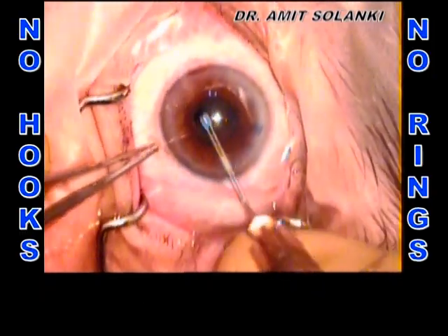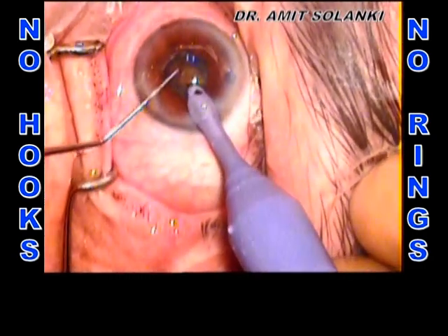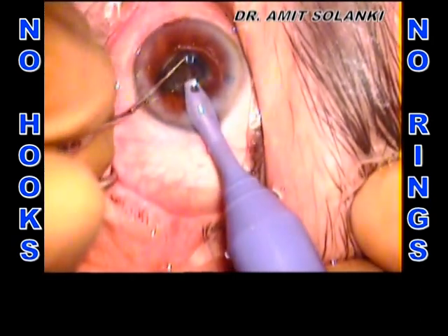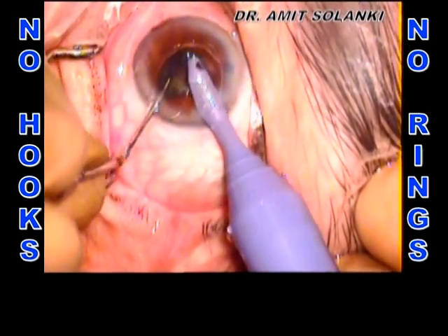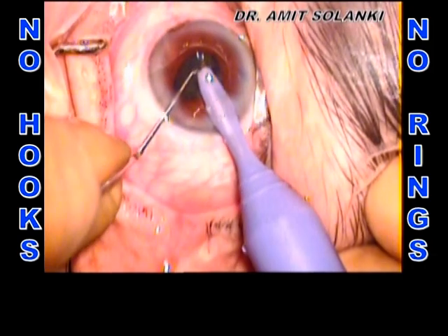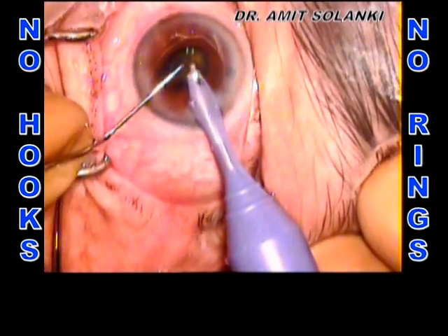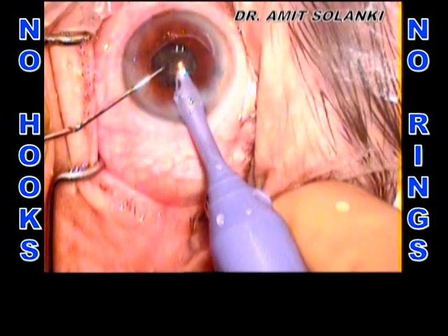After hydrodissection and nucleus rotation, the first step of phaco is the initial crack using the chopper and phaco tip. The center of the endonucleus was buried with the phaco tip, and then the vertical element of the chopper was depressed posteriorly to initiate the crack. The heminucleus was then mechanically divided into multiple small fragments using the phaco chop technique. Make sure that chopper movements are restricted within the rhexis margin — if it moves from periphery to center, it may tear the anterior capsule. The divided smaller nuclear fragments can be consumed within the central area at the pupillary plane. Sometimes it may be necessary to bring these fragments above the plane of the pupil, but always protect the corneal endothelium while emulsifying them there.